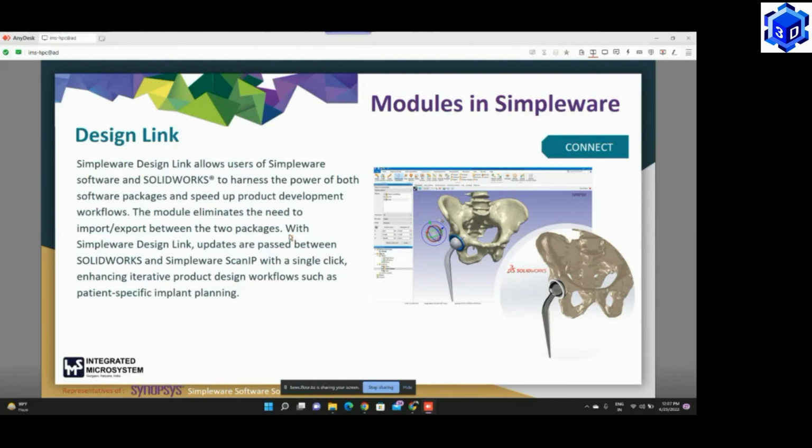For the segmentation, as I've told you, there is an auto segmentation section also, which allows you to segment some specific body parts for cardiovascular or orthopedic applications. It's very easy. It's completely based on AI. You simply choose a model and it will automatically segment the whole data set for you.